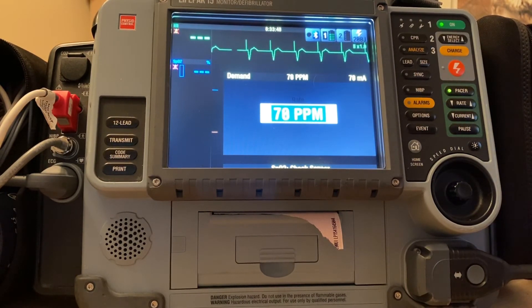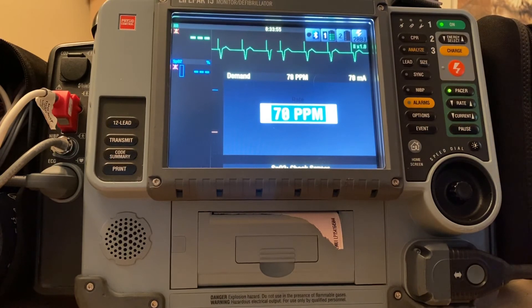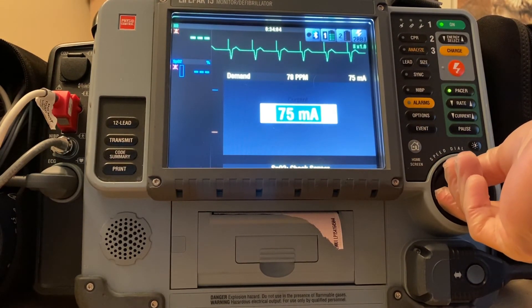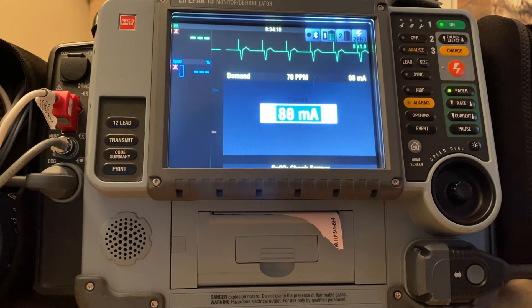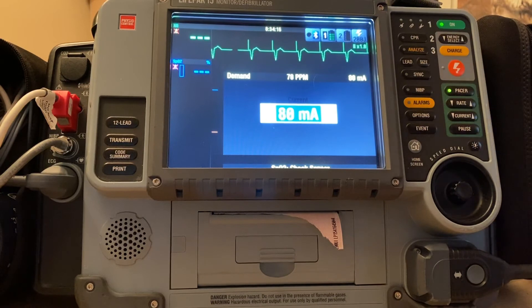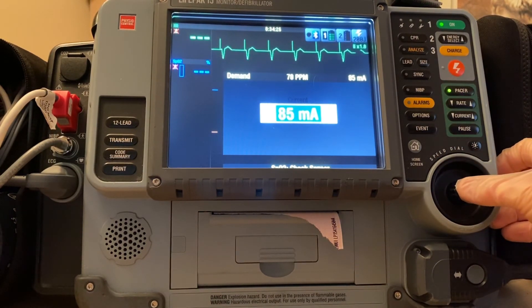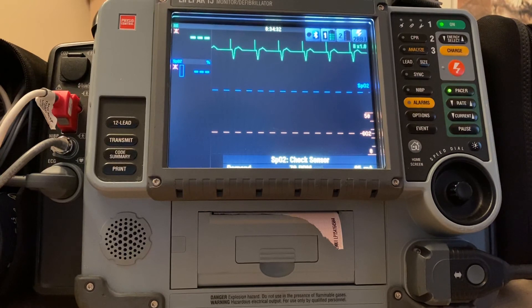At this moment, we should be feeling the patient's pulse — probably their femoral pulse — and checking for mechanical capture. If we don't have mechanical capture, we'd go up on the current a little bit more. I try 75, still feeling for that pulse. Try 80 — I've got mechanical capture. My patient now has a pulse of 70 per minute, hopefully a fairly strong pulse, and hopefully this has raised their blood pressure into a more normal range. Once I've got mechanical capture, I'm going to put it up one more bit — five or ten milliamps — just to solidify that capture. And I am done. I have a patient who is now being paced.